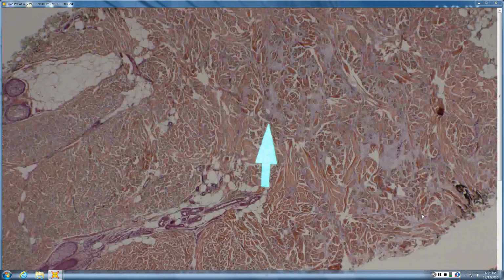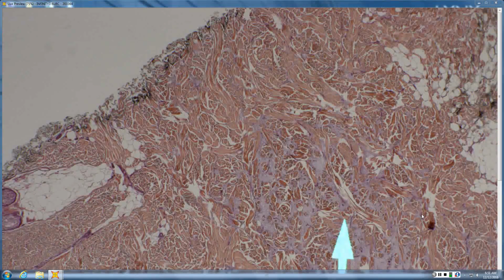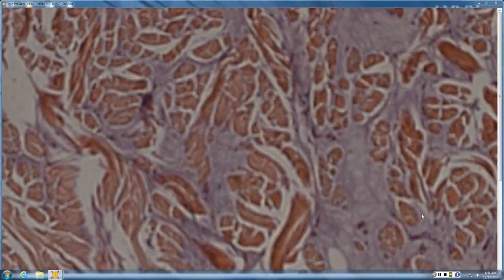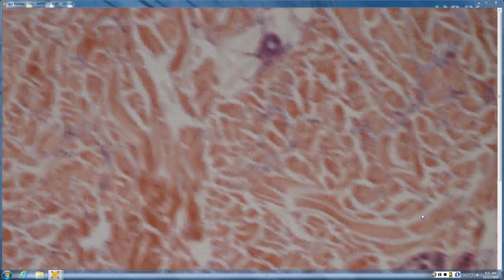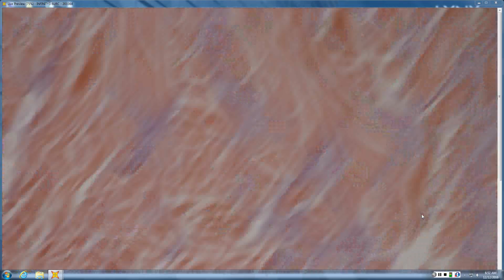Okay, so first thing you notice about this is what? A lot of mucin. Yes, there is a lot of mucin in this one, and in a lot of them there's not this much. But the first thing I notice is look how thick that biopsy is, right? Look how thick the dermis is. That's your first clue. And then when you go down and take a look, this blue stuff in here is mucin. You could stain it if you really wanted to. I'm not sure that you need to at this point. Where is it situated? Pretty deep down. Right, so most of the mucin is deep.